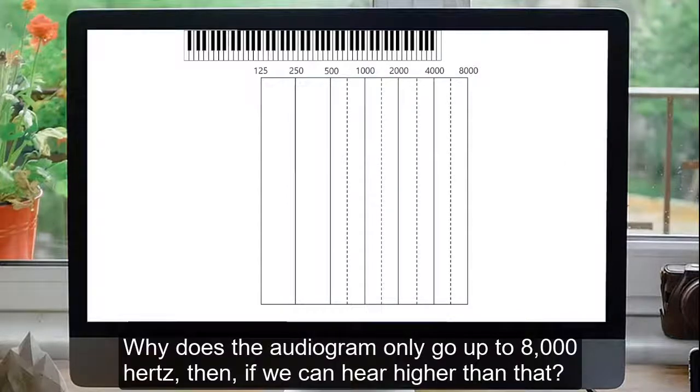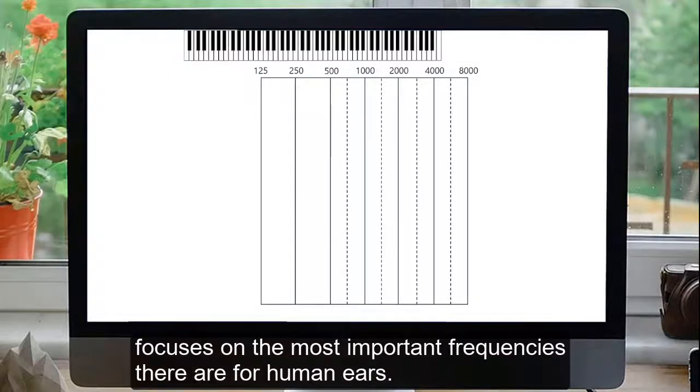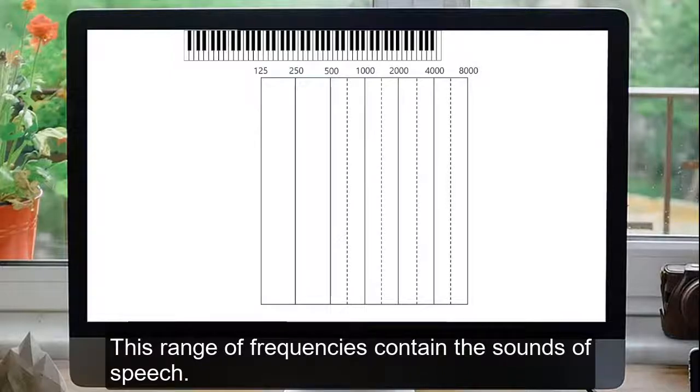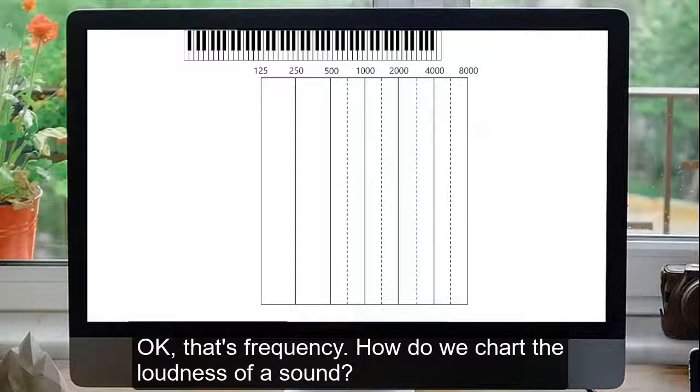Why does the audiogram only go up to 8,000 Hz then, if we can hear higher than that? It's because the audiogram focuses on the most important frequencies there are for human ears. This range of frequencies contain the sounds of speech.